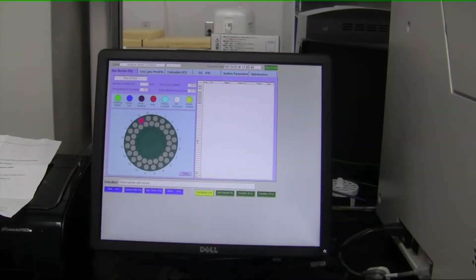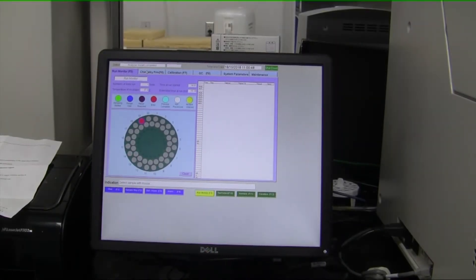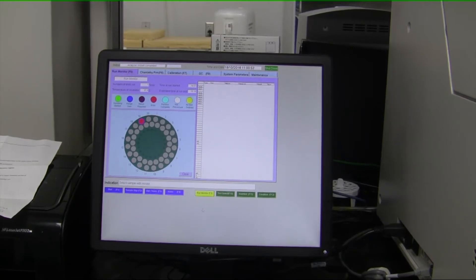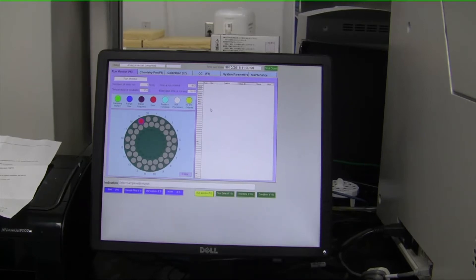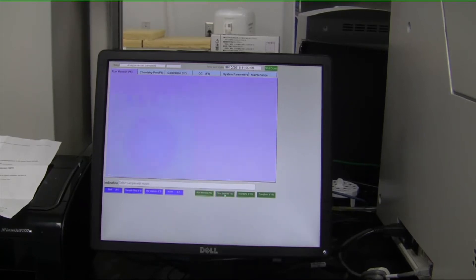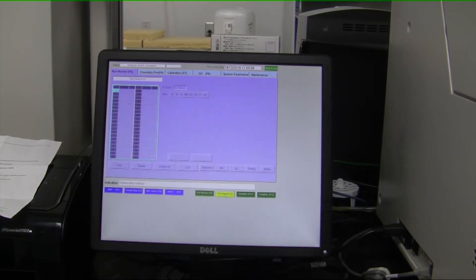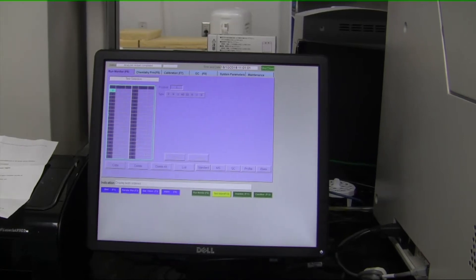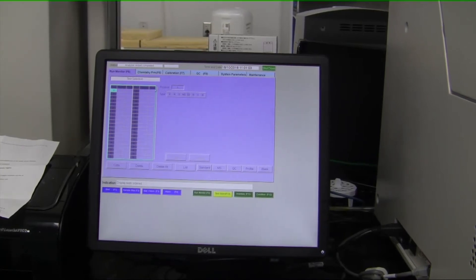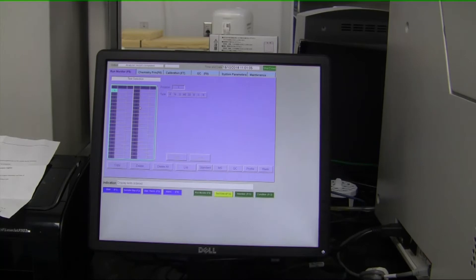I can now tell you a little bit about the user interface for the Randox system. This screen here is under the run monitor. It's called the run monitor screen. It just gives you a basic overview about where the sample status stands. Under test selection, you would enter in all of your samples, whether it be an unknown sample or a normal sample type.